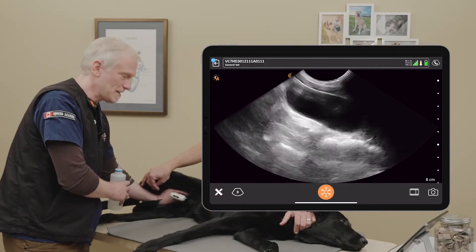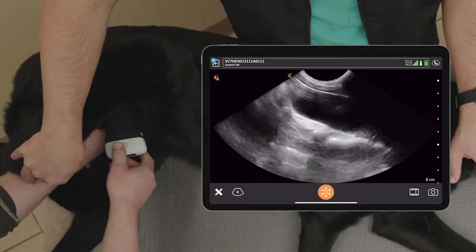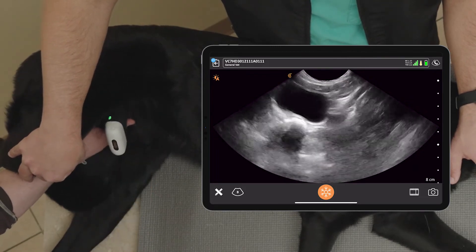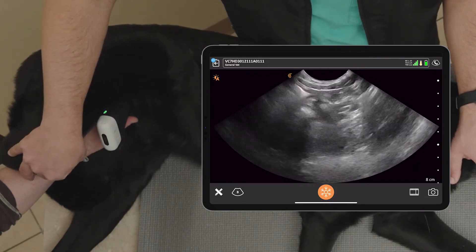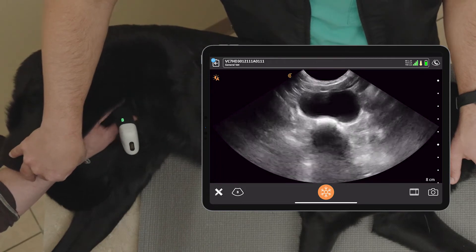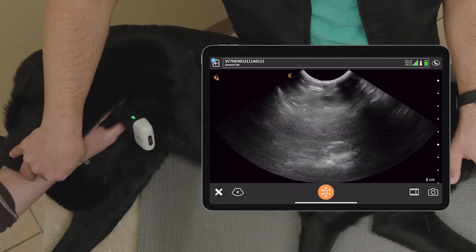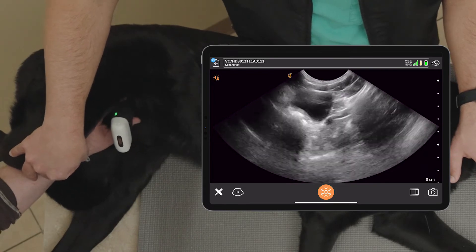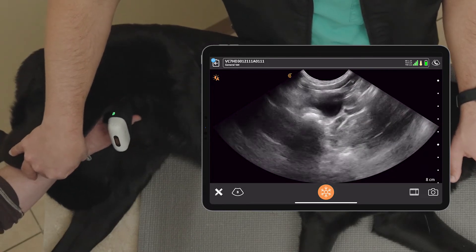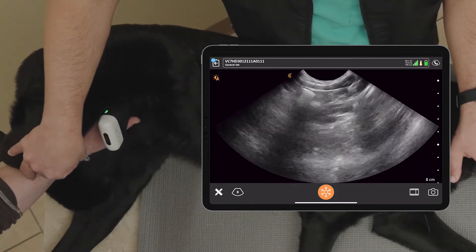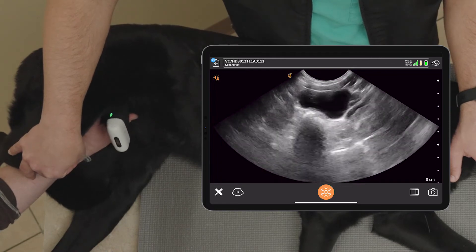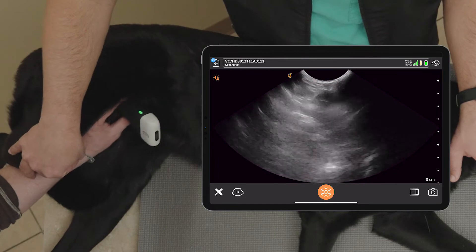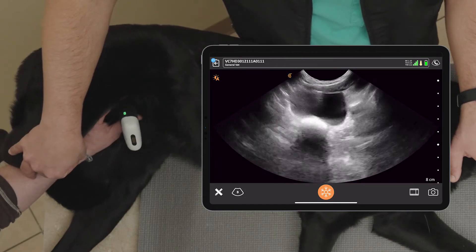Now once we've done that in long axis, what do we want to do? You want to go ahead and rotate the probe into short axis and do the same thing. You're going to fan and we're looking for free abdominal fluid — yes or no. So we'll go all the way back to the trigone, fan and sweep a little bit. This is a large bladder so I have to do a little bit of fanning and sweeping off the apex. No free fluid. No obvious abnormalities in the bladder itself. We see the colon there. No obvious stones. So that's short and long axis.